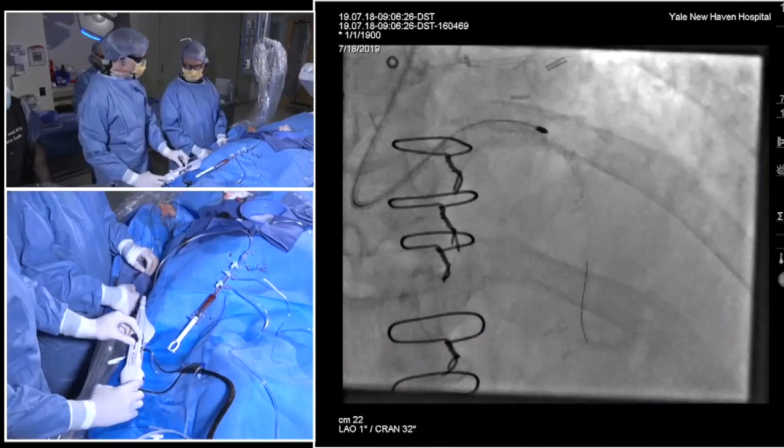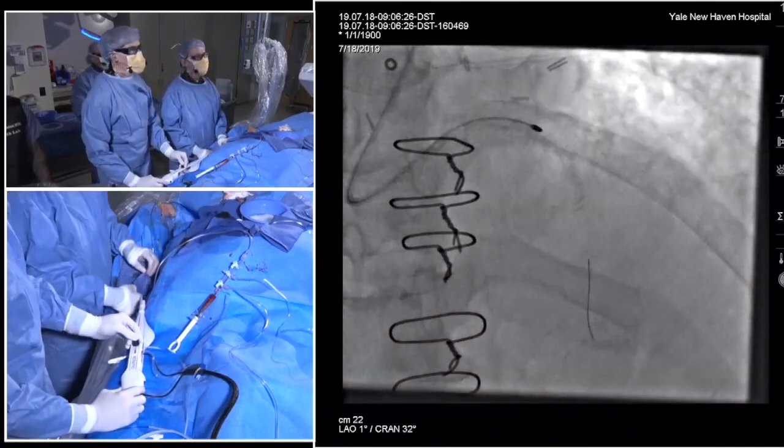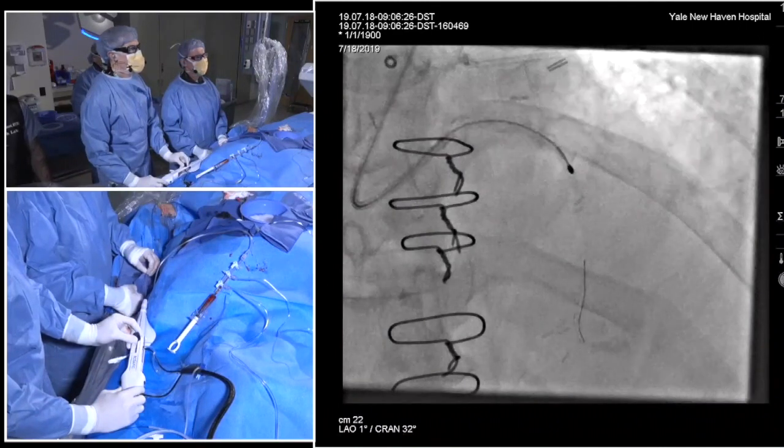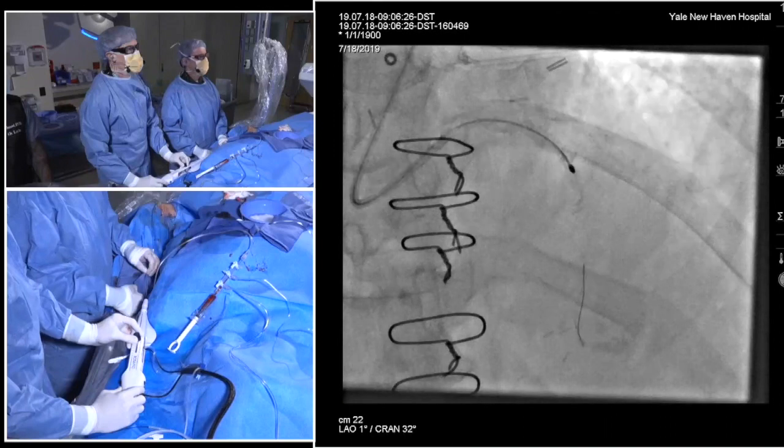Yeah, I think it's an important point to make for the audience in particular, because at times you have all these different options, and it's always good to have an algorithm, at least in your head, as to how you make the decision between one or the other.